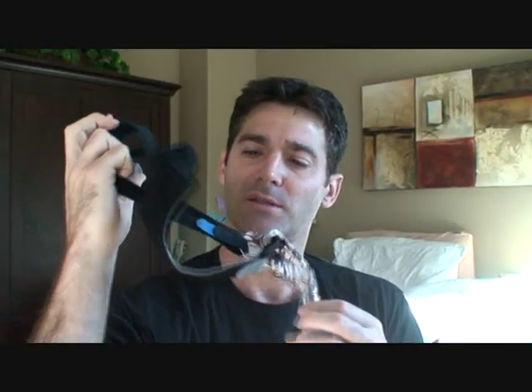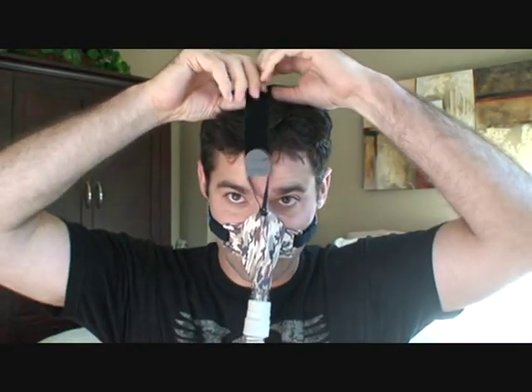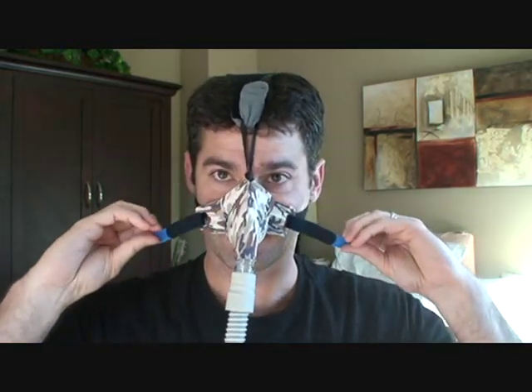With the newer headgear, you can see it has the blue tabs on the side. The older mask didn't have the newer tabs like that. I apologize, here I sound drunk. This is actually the first time I'm putting it on, so I have this attached to a CPAP machine. I'm going to see how easy it is to get it to seal as a beginner. So this is like someone in your position who's taking it out of the package for the first time. This is just with the newer headgear. It's actually pretty comfortable. I liked it. A little wider, distributed the pressure more, and it was softer. Just turn the machine on.